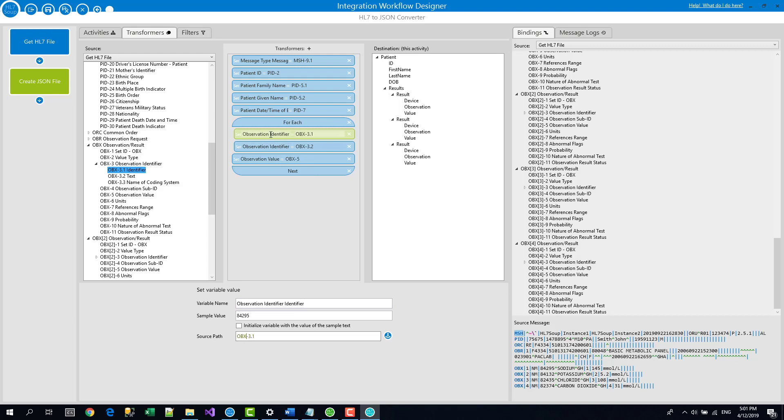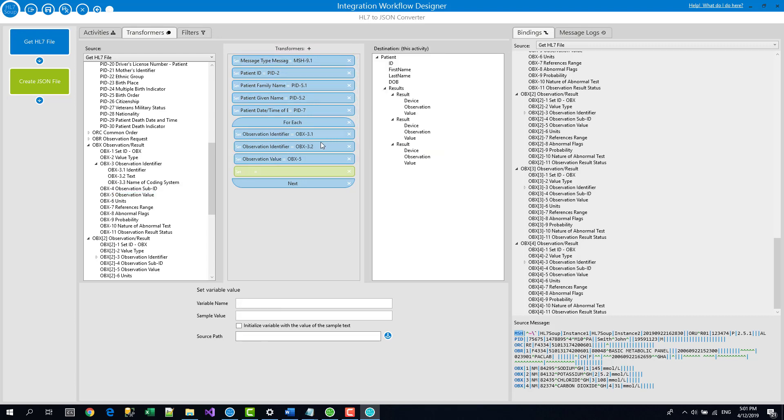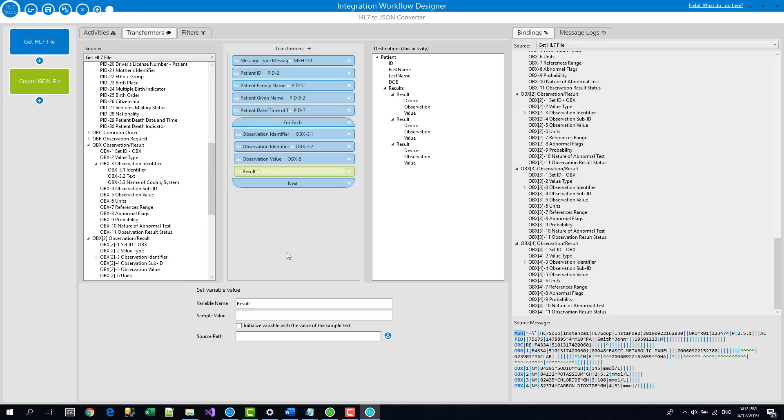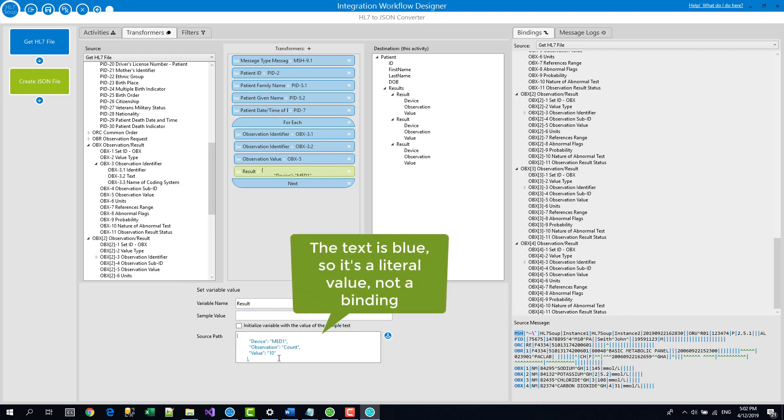And of course, so these are now in variables and we can add these variables back into that text. So in order to do that, we need to create another variable and I'll add it below this one. And I'll go set variable value and I'm going to call this variable results. And into that, I'm going to add in that text that I grabbed from the message, the destination message. If I click on that, I can actually see that message again. I'm just going to grab it again because I don't trust my copying. Copy. Click back on there and paste that into the source path.